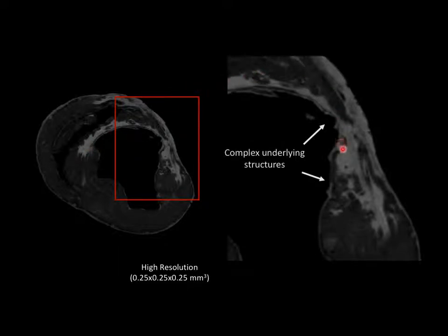So we've used these high-resolution images to try and model electrical abnormalities running through infarcts, because normal tissue that's inside here will get excited, and the electrical excitation will run through there. It just runs through more slowly than in normal tissue. And so it would be great if you could make pictures like this in people and then do a simulation to determine whether they need a defibrillator. The problem is making pictures like this in people that are alive is very, very hard.